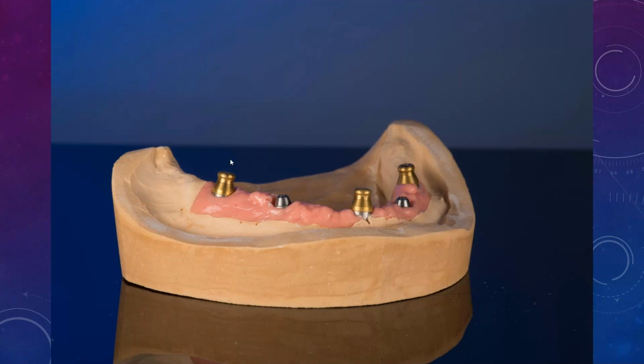And as you can see, I'm only using 3 locators, okay? Because that's enough. I just need to tripodize that bite rim or the setup. It works pretty well. Does this always work? No, it doesn't, because if you have a lot of divergence, for example, sometimes it's difficult to put all 3 where they're going to line up. So sometimes you're going to have to do screw retain. But I would say 98% of the time this works pretty well.